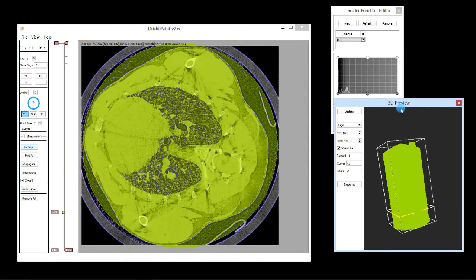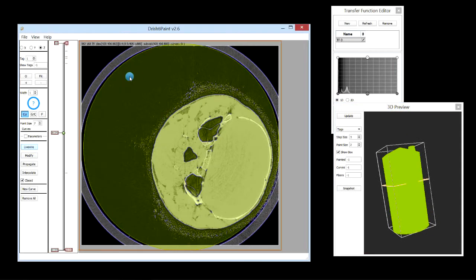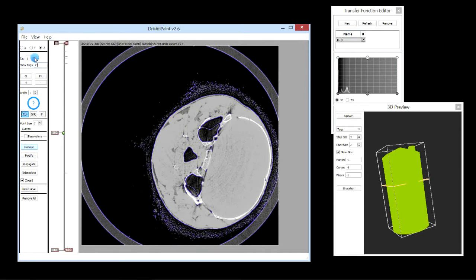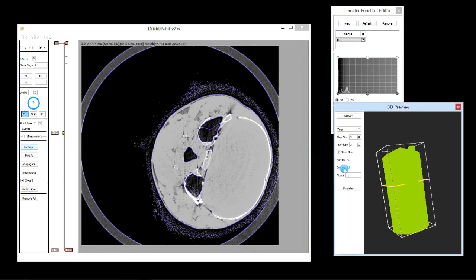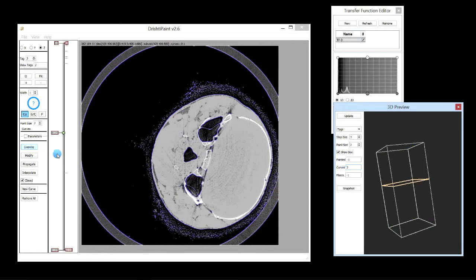Before that, let's turn off these green curves showing tag 1. We don't want distraction while we are trying to segment the lungs, so let's turn them off. Let's show tag 2 — that is the tag we are going to use for tagging the lungs. Select tag 2 here, and we also want to show only tag 2, only the curves that have tag 2.